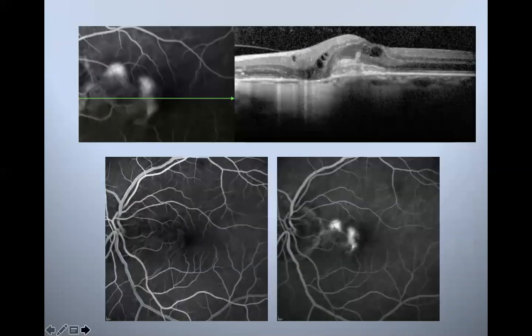Here's another quick case too. Fluorescein angiography, again, leaks like crazy. The optic nerve's over here, so it's sort of a parapapillary neovascular complex. On OCT, you can see there's some loss of retinal pigment epithelium, so that foundation's gone and all the upper neurosensory retina's kind of caved in. And you can see there's mass going on here, and there's intraretinal fluid. So on late fluorescein angiography, you can see that there's leakage early on. Now that we know we're talking about a RAP lesion, it kind of gives it away that this vessel right here looks a little suspicious going through there.